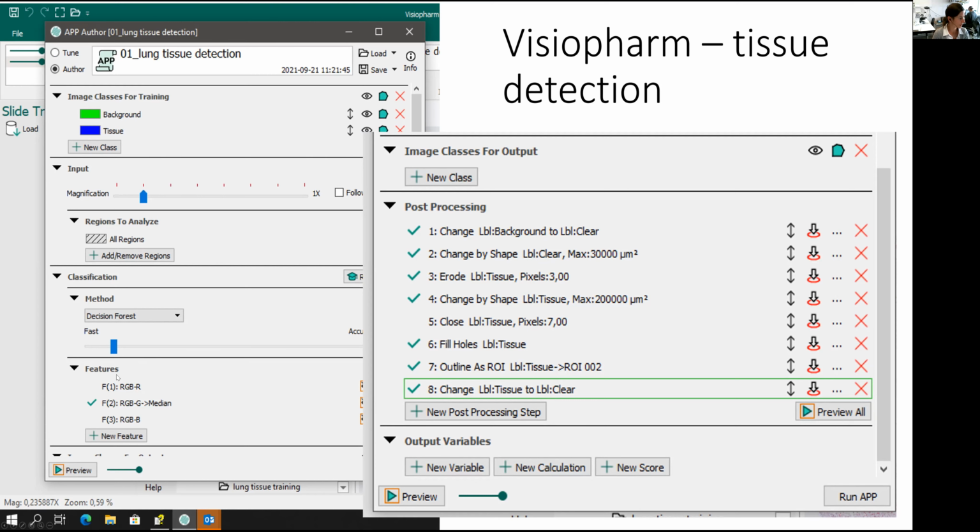And of course, I can also see, depending on the feature, which actual channel, for example, color channel, is best used to distinguish that. What I find rather useful is that even after processing, I can manually adapt and add some steps.